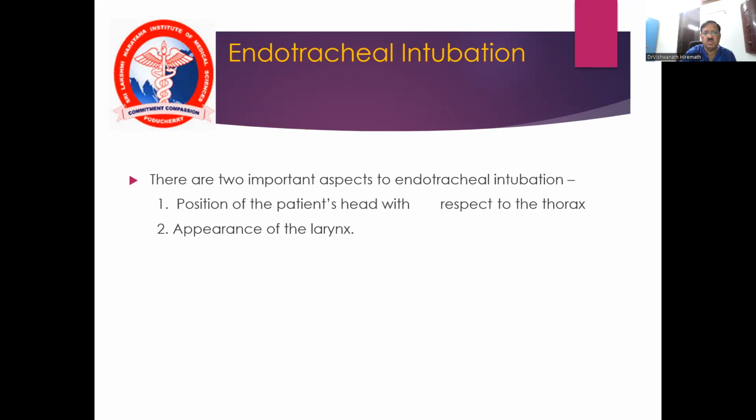The two most important aspects in endotracheal intubation are the position of the patient's head with respect to the thorax and the appearance of the larynx.